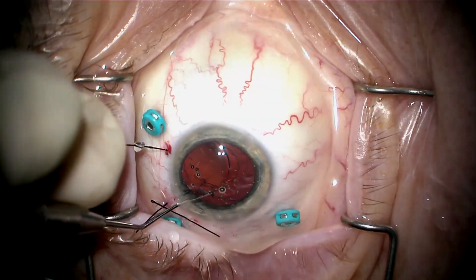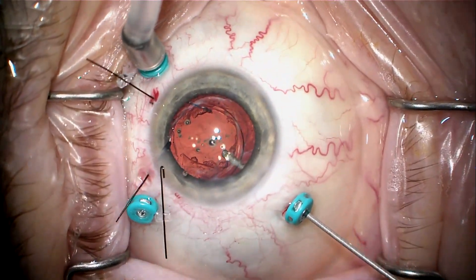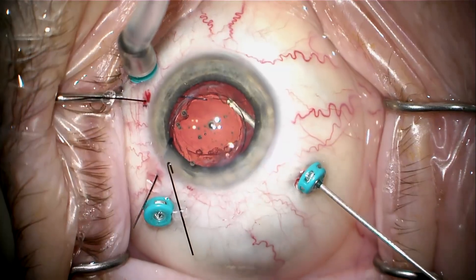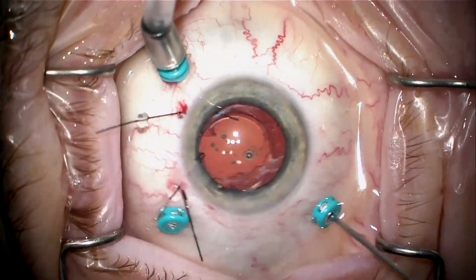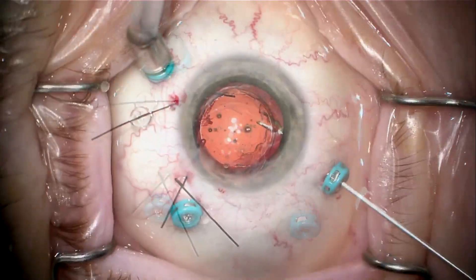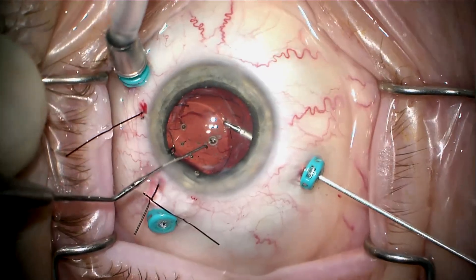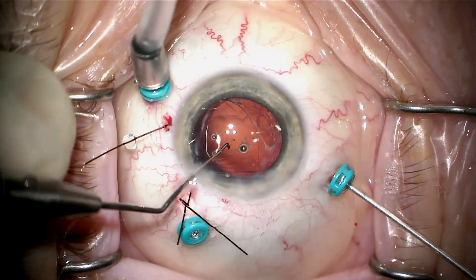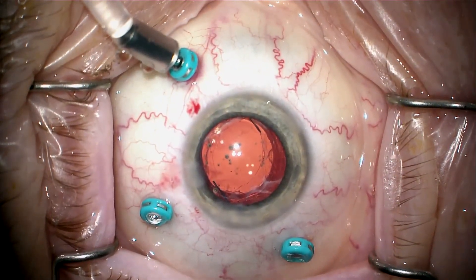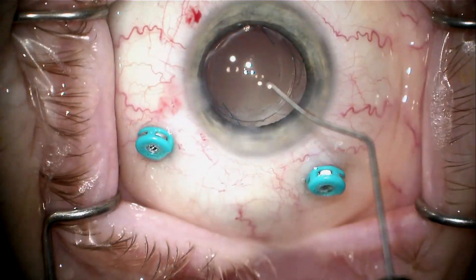The new lens is going to be injected into the sulcus, dialed into position, and I'm going to do some pars plana vitrectomy to make sure there's no vitreous coming up. I'm also going to remove some of the Soemmering's ring material that was in the capsular bag. Once I've done some vitrectomy, I want to optic capture this lens. The rhexis opening is still pretty small and tight, so I'm going to use a maxi grip 4.6, modified so the jaws open a little wider, to come through the pars plana, grab the edge of the lens, and pull it right through the anterior capsule — pushing one side while pulling the other. This is a very non-traumatic way to create optic capture of a three-piece silicone lens with a fairly tight rhexis. The lens is now nicely and securely optic captured, and I'm injecting diluted triamcinolone through the pars plana.